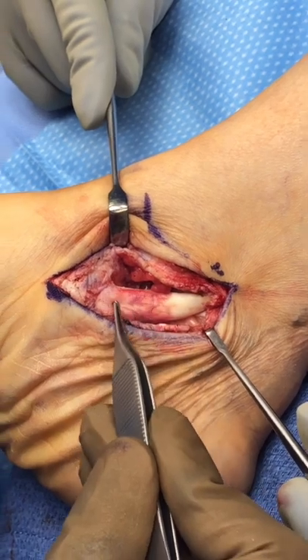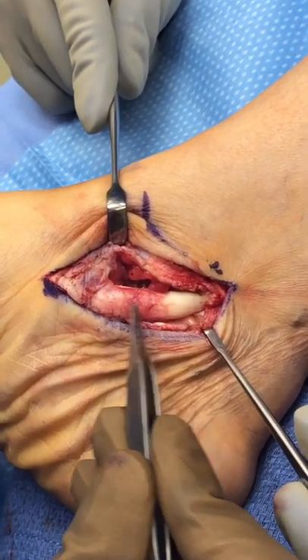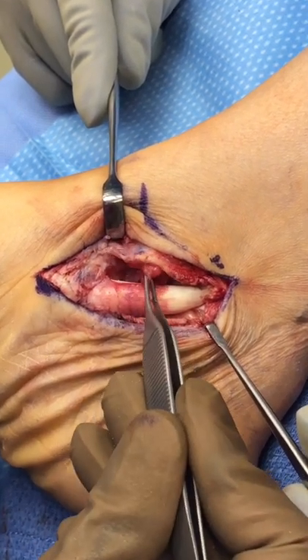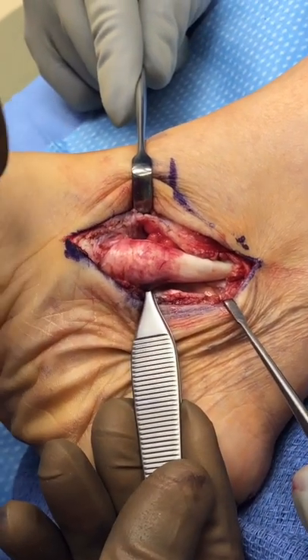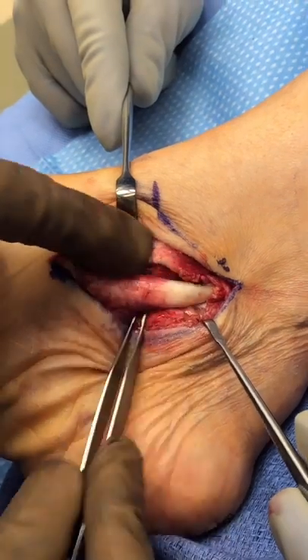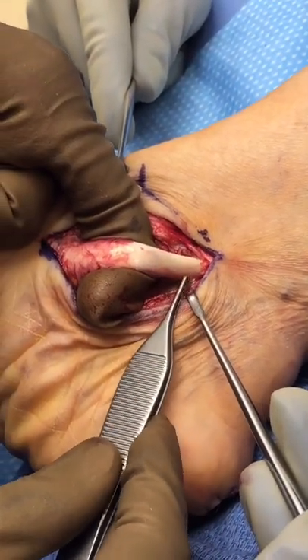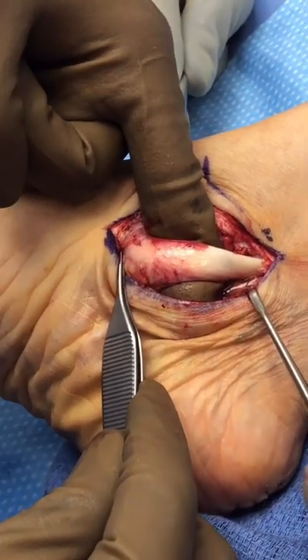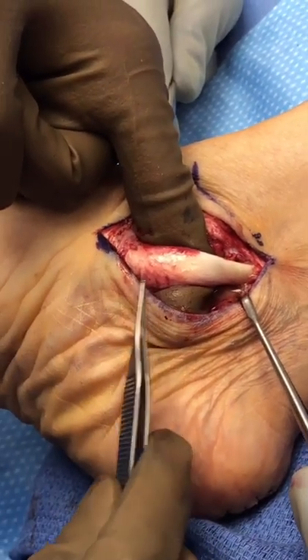This is the posterior tibial tendon, and you can see all the erythema — the redness — and a lot of inflammatory tissue. You can see how thick the tendon is. It's really supposed to look more like up here, where it has a nice white shiny appearance and is relatively thin. As it gets down to its insertion where it hooks into the navicular bone, it has become very thickened and diseased.